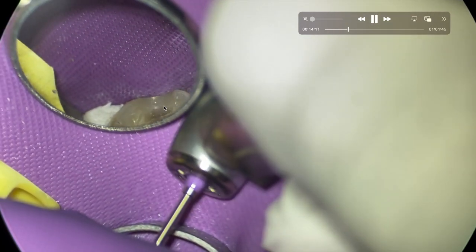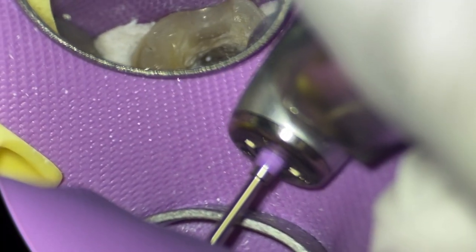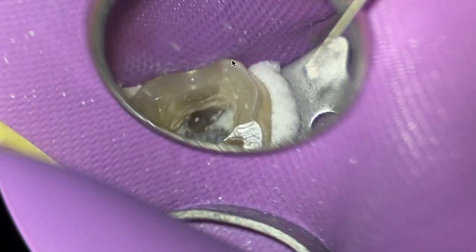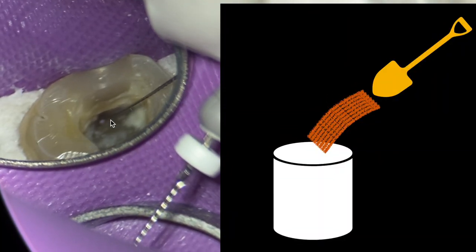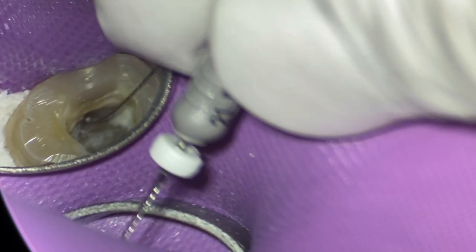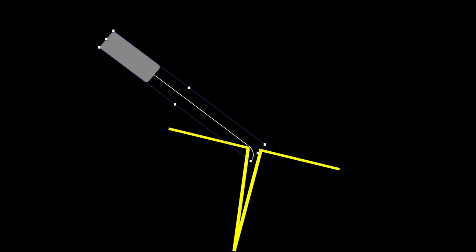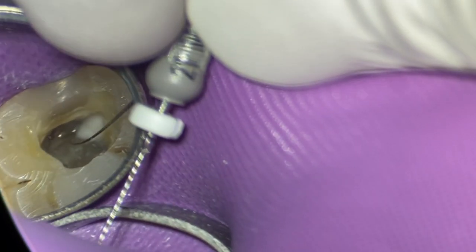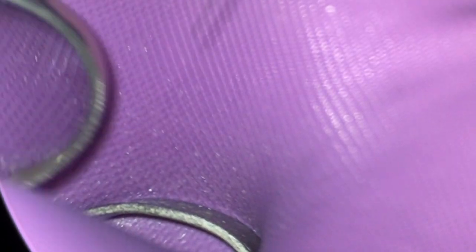So what we're using is a slow round burr, Muntz. This is the purple, and what I'm looking for, I'm looking for little dots and I've got one right there and I'm like, oh, well, maybe that's it. Sweet, right? So I'm just going nice and slow. In the back of my mind, I know that this is roughly the area where MB2 normally is. So you can see that white dot right there. I'm like, well, that's a dead giveaway. What's happening is that debris is getting caught into that orifice.